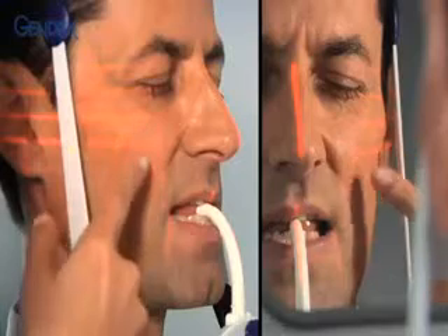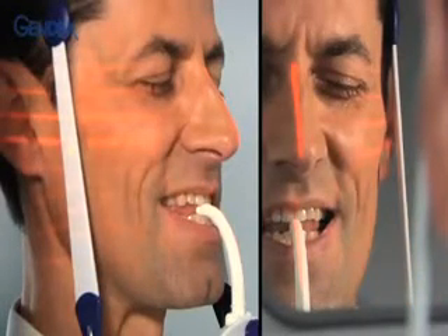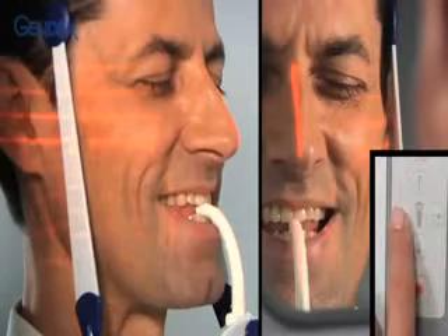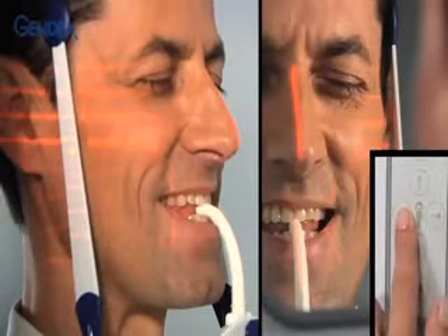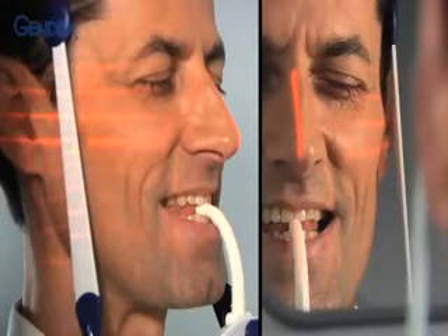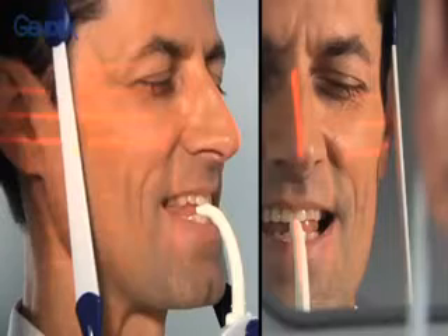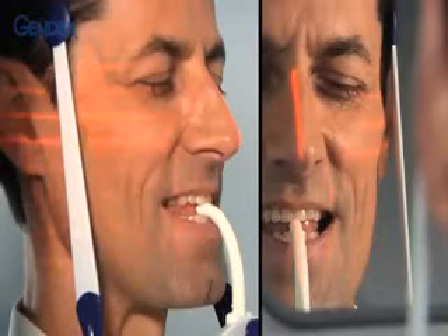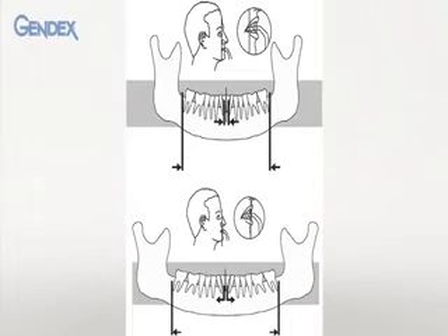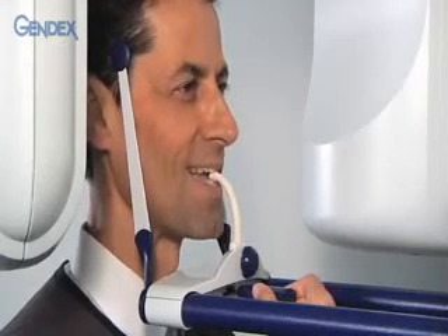Next, adjust the lateral vertical line while ensuring that the patient doesn't move. Use the forward and back buttons until the laser line is positioned in the center of the upper cuspid. If the patient is too far forward or back of the vertical line, the image will be shortened or elongated respectively. To stabilize the patient, carefully adjust the head supports so that they are gently pushing against the patient's head on either side.